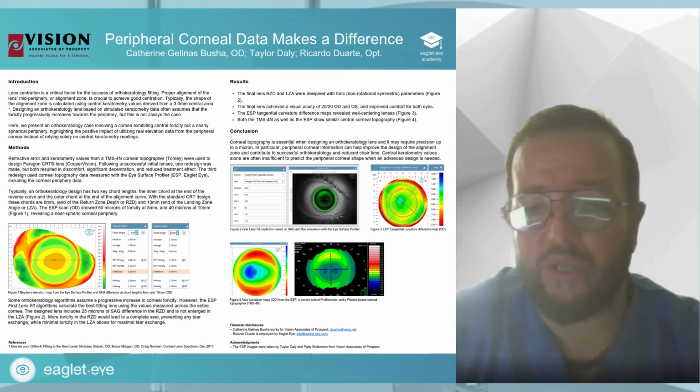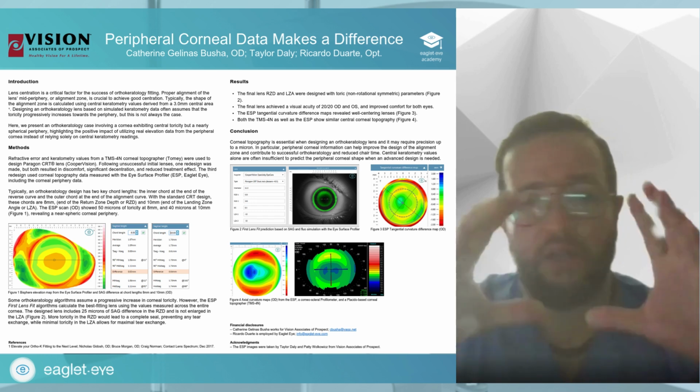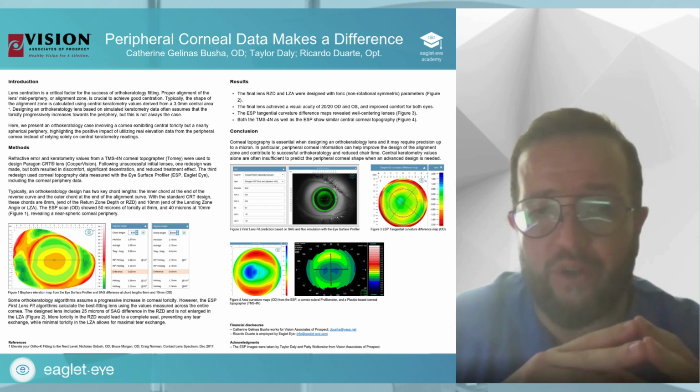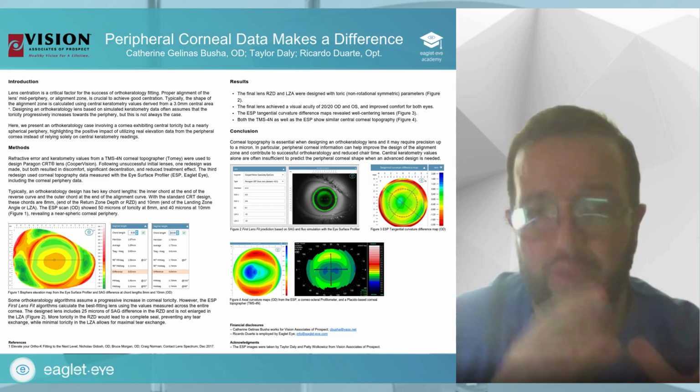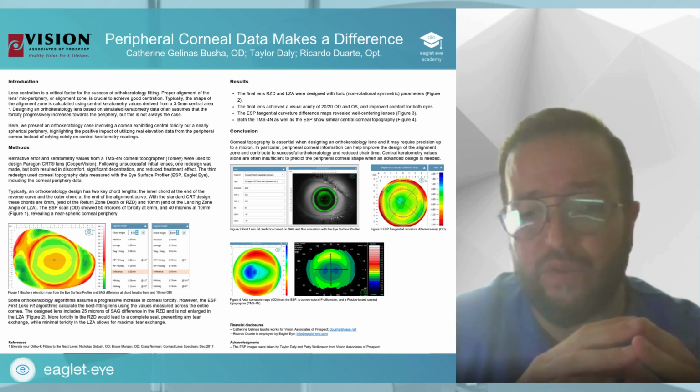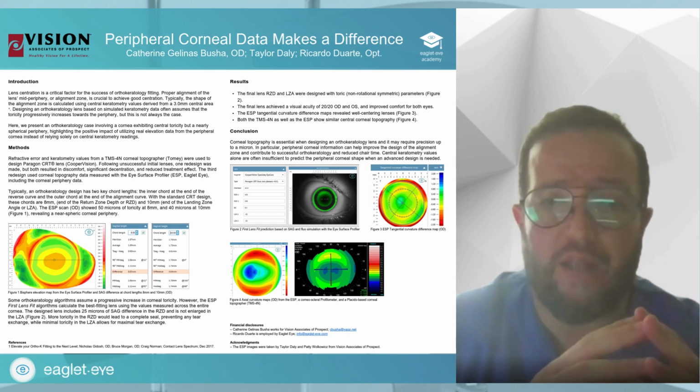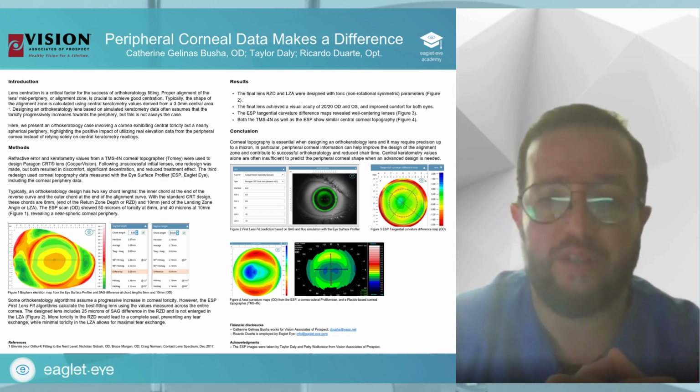So as you can just check on the tangential map, and you can just see like this well-centered red ring on the map. And as well, if you look at the curvature map on the ESP and the Tommy topographer, you can see that bullseye, and that is what we always try to achieve.